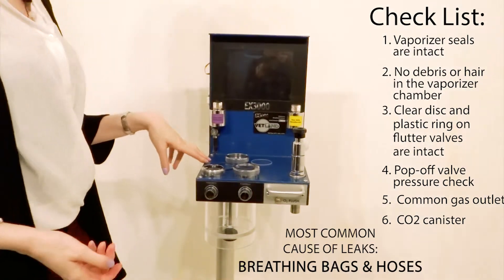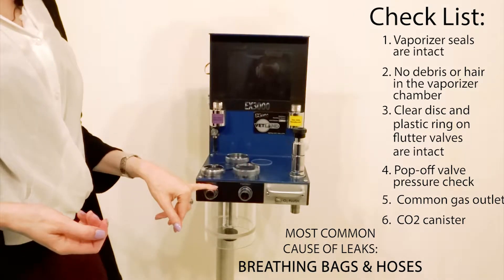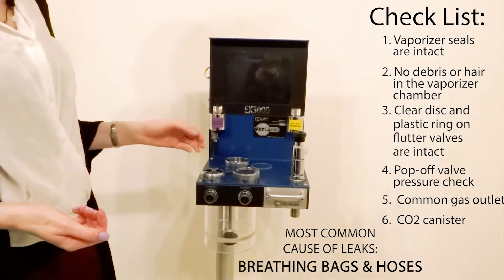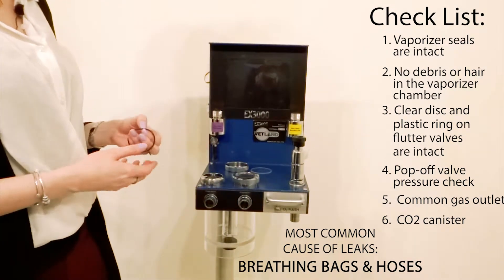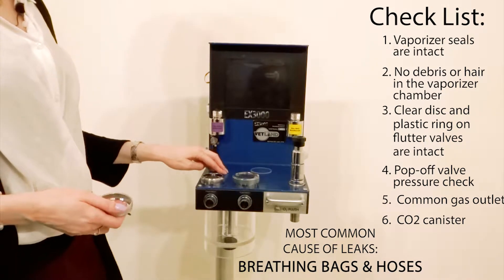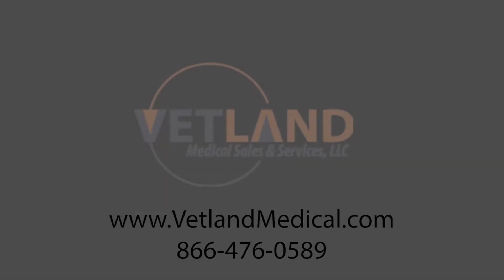The most common cause of leaks in these machines — either the EX3000 or the 2100 — is going to be the terminal end towards the patient. Your breathing bags and hoses are typically what get leaks because those are considered disposable. After you've checked those and all the things on this machine, hopefully you can identify the issue.